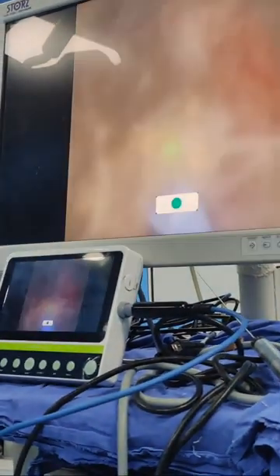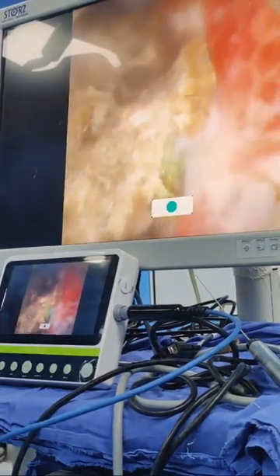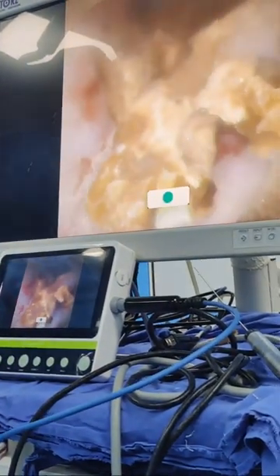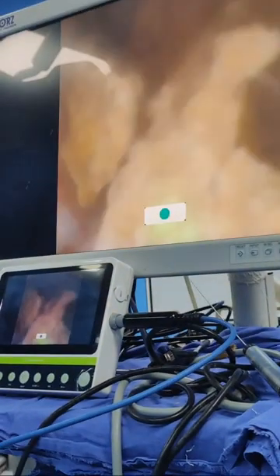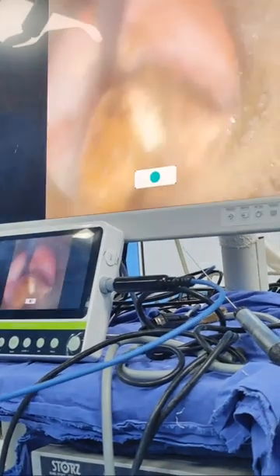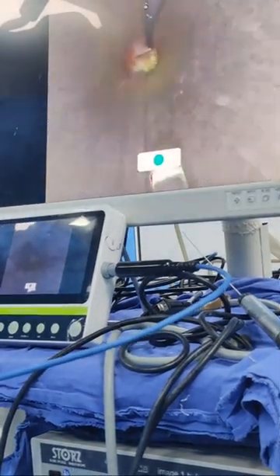Because of the suction, the strong effect of the laser is not seen because all the fragments are continuously sucked actively, and therefore the lithotripsy can become faster because the vision becomes immediately clear. Then you break that. So the suction.